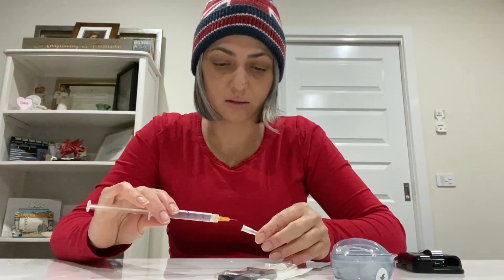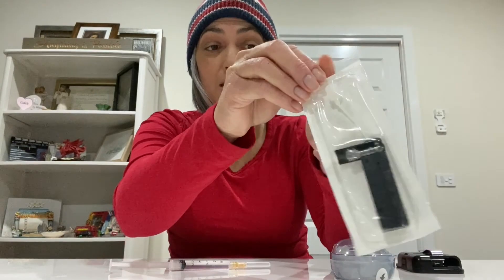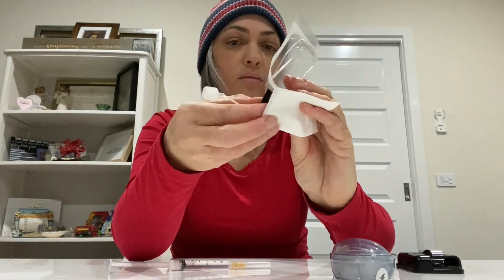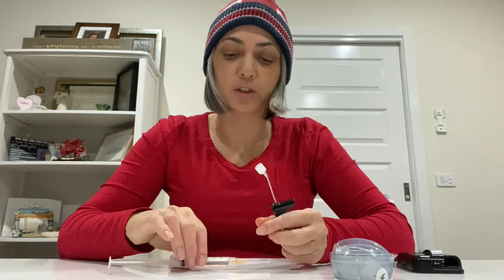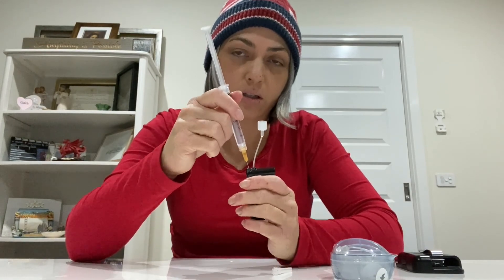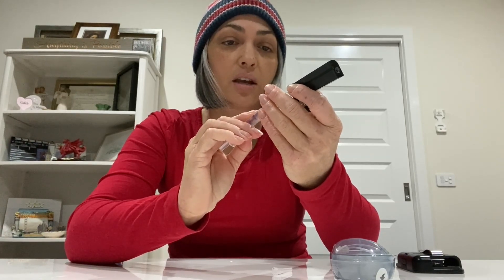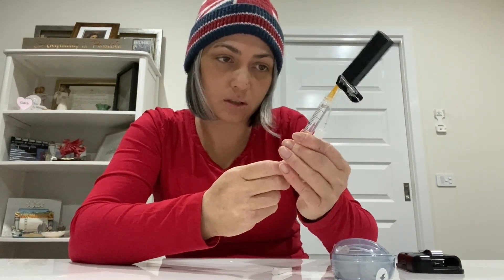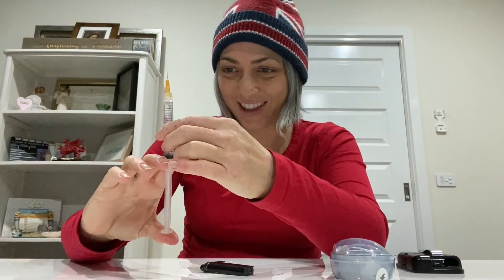I'll pop the lid on the syringe and open my brand new empty cartridge. You'll see there's a little white dot — I'm going to pop the syringe in there and draw back just a little bit in case there's any air. There shouldn't be, but they do say to do that as a precaution. Then just shoot that air out.